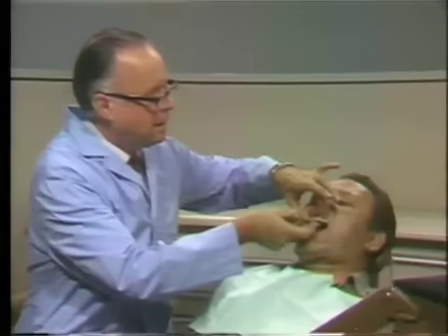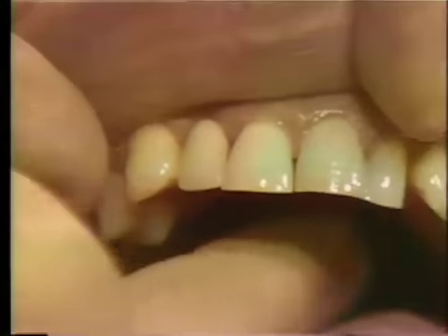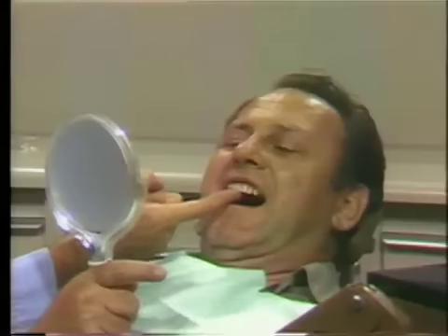Now we'll place this in position in the mouth and check it for shade. Now we'll give our patient a hand mirror, and he can take a look at the situation and see how it appears to him. How does that look to you, Mr. Steinhauser? That's good. You can see that there are several possible positions for that. We tried to blend it into the adjacent teeth. It's not quite the same relationship as the tooth on the other side, maybe, but it seems to us as though it would blend in quite nicely.